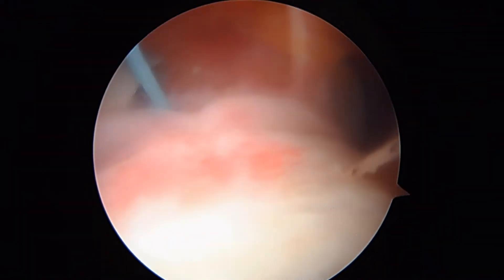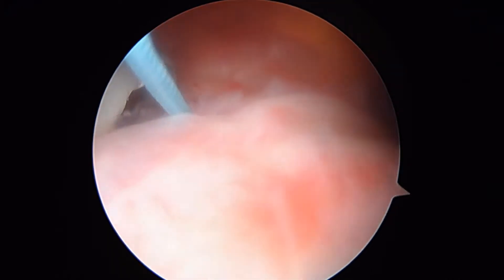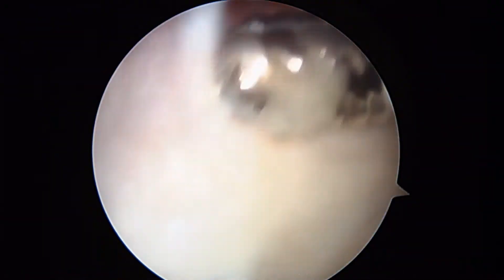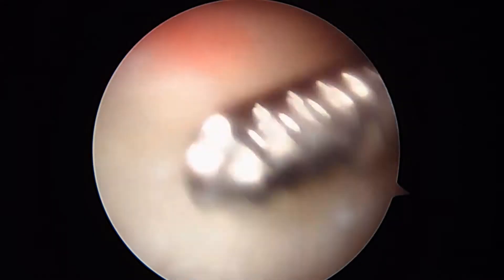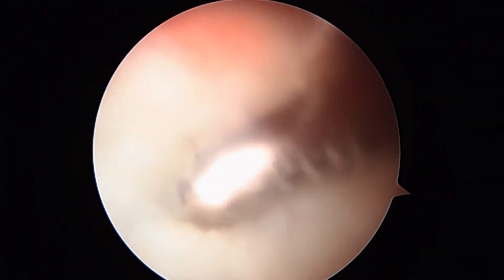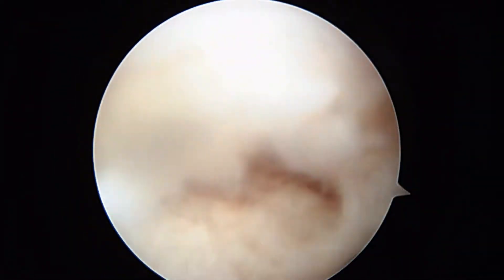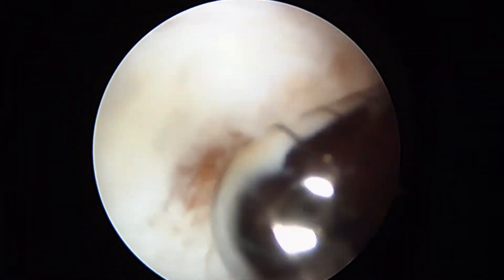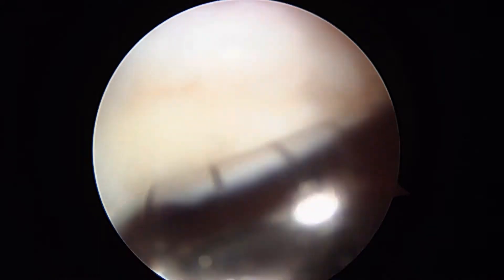I want to show you where this tendon's torn on this side. Remember at the beginning of the case I said that sometimes the tendon's torn on both sides and we end up having to repair it like a full thickness tear — and that's exactly what's going on. Look here. You can see a hole in the tendon right there. So we're going to go ahead and open up the tear right here and repair this as a small full thickness tear.